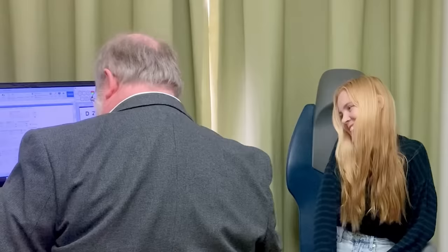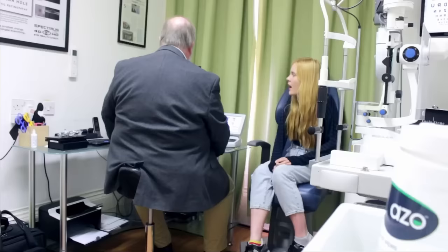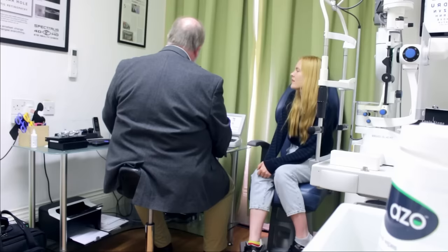Close to, yeah, not such an issue. Your near vision does what it says on the tin. You're short-sighted, so you can still see close to. You have a wee bit of astigmatism, which is to do with the shape of the eye. Yes, that's what I meant. Sorry, with my mum, it was astigmatism. Okay, fair dues. Yeah, so you have a little bit, but not a lot. But as you saw, it just makes it absolutely pin sharp when that's in there, but you've only got a small bit. So it's not a huge problem for you, okay?